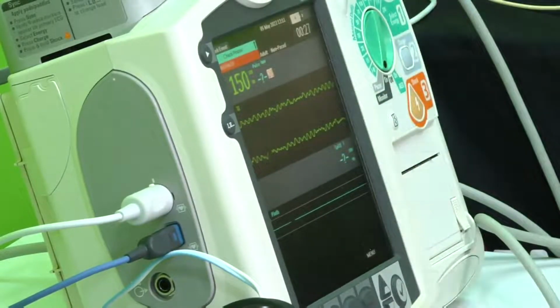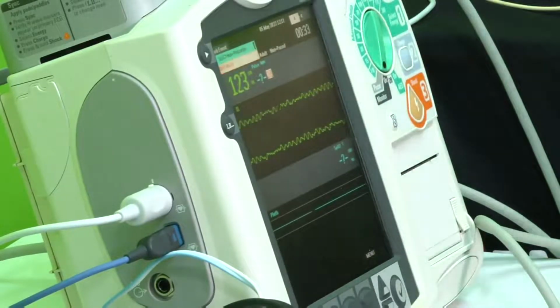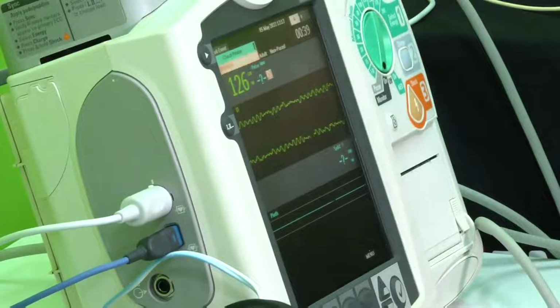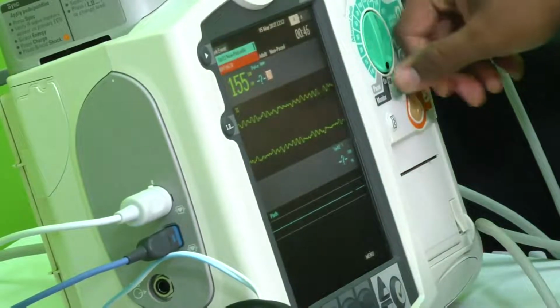As I said, what the shock does is neutralize all electrical activity, because ventricular fibrillation is chaotic electrical activity in the heart. By shocking the patient, you neutralize all electrical activity, allowing the heart then to pick up from its SA node and convert to a normal rhythm. Now, I just want to emphasize, let me just switch it off. It's very disturbing to have a VF on the screen.